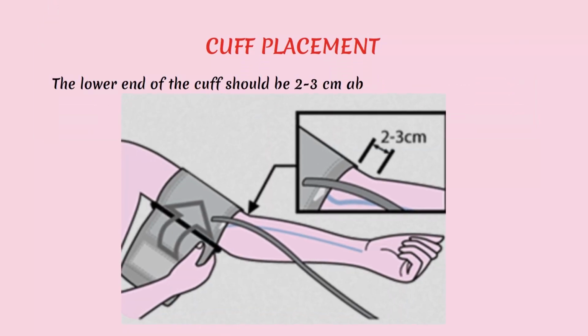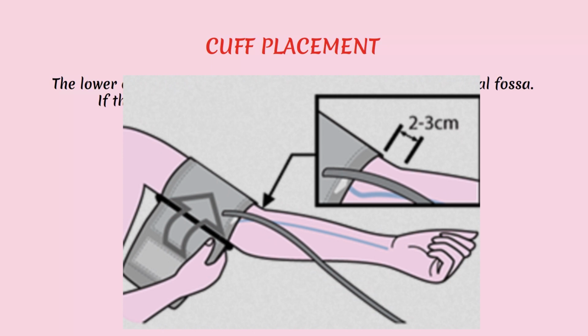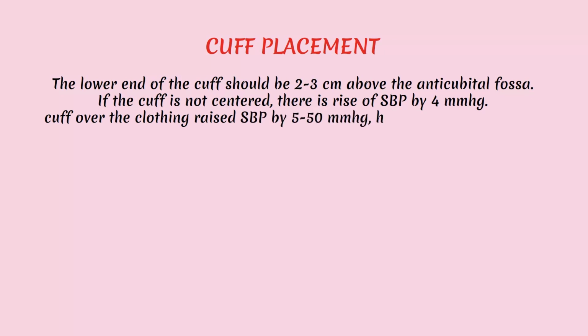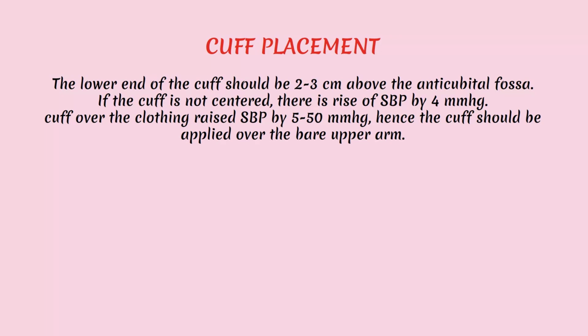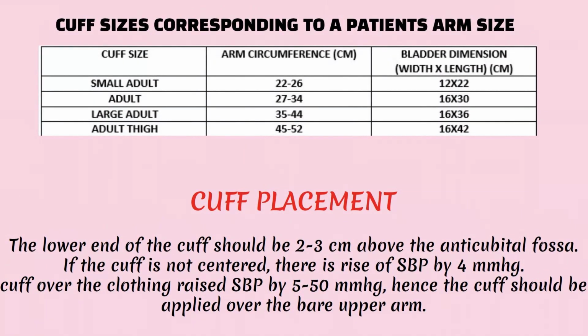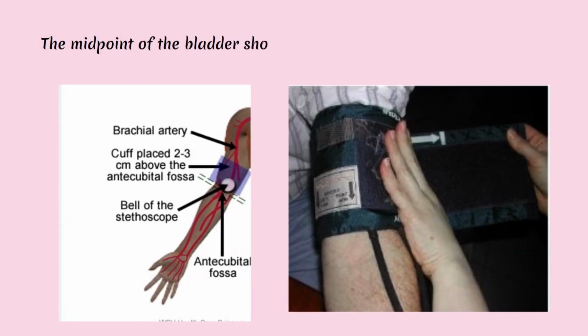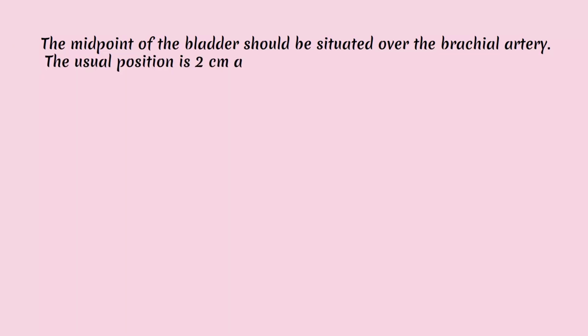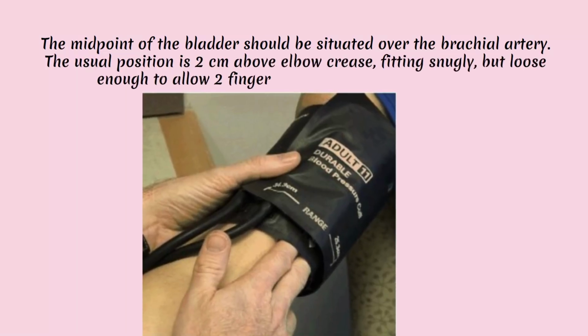The lower end of the cuff should be 2 to 3 centimeters above the antecubital fossa. If the cuff is not centered, there is rise of systolic BP by 4 mmHg. Cuff over the clothing raised systolic BP by 5 to 50 mmHg, hence, the cuff should be applied over the bare upper arm. The midpoint of the bladder should be situated over the brachial artery. The usual position is 2 centimeters above elbow crease, fitting snugly, but loose enough to allow 2 fingers between the arm and the cuff.